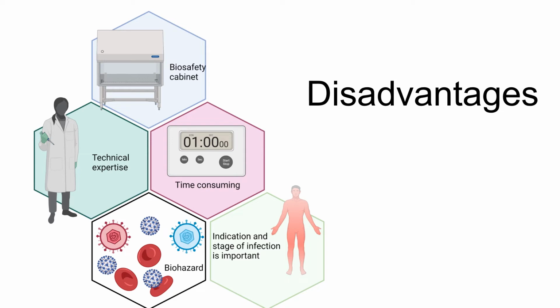You have to use aseptic techniques because you're removing blood from the patient, labeling it and putting it back into them. So you can't do this on a bench top or in an unregulated environment. It is time consuming. It takes more than an hour to label these white blood cells. The patient has to wait and you need to know how to do it. So people need to be trained, and it's quite a difficult procedure from a radiopharmaceutical perspective.